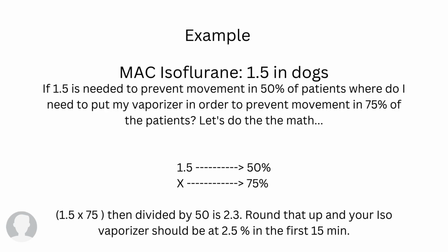Don't be scared if, when using sevoflurane, you're faced with a higher vaporizer concentration as compared with isoflurane. Sevo MAC is higher as compared with ISO. Higher MAC and low solubility allow for rapid changes in depth at induction and recovery. So just keep this in mind if you're not used to using sevo.